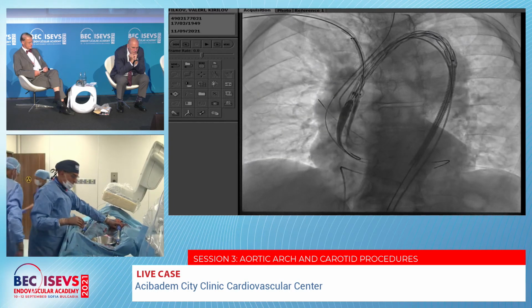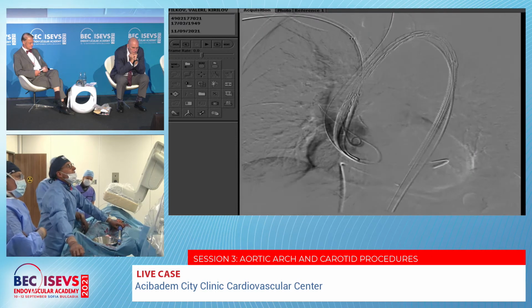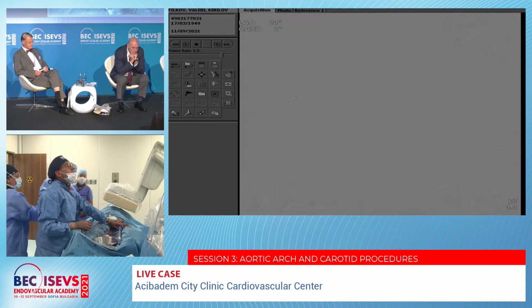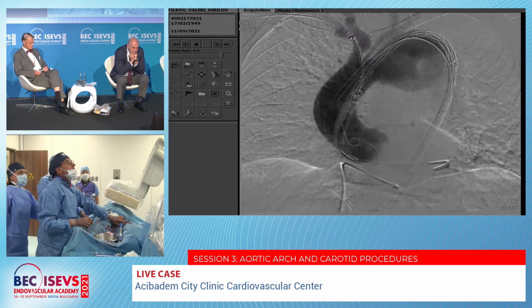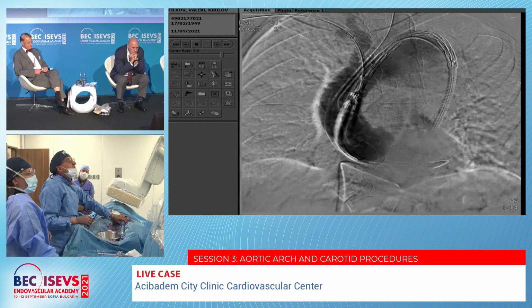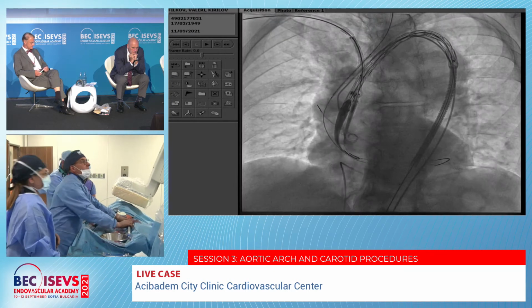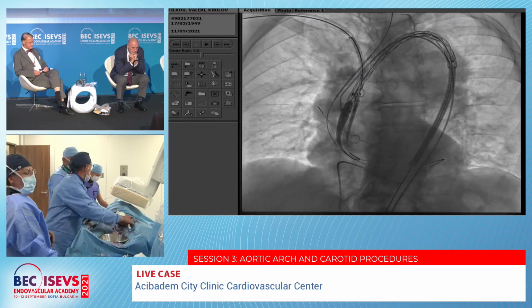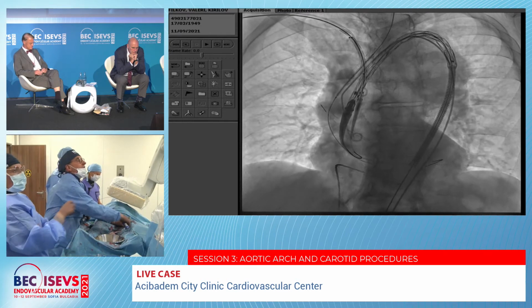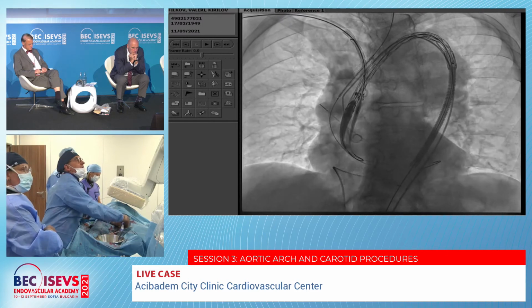Yes. Probably we are going to need an injection. Yes, definitely the chimney into the left carotid is there, and also the right one is just on the bifurcation, I mean the distal. So we are ready to start. 160. Okay. 160. Now. Now. I'm going to only free flow.